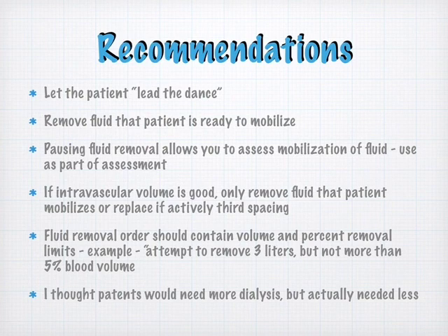And I also feel that since it's really difficult to predict how much fluid to take off, that could be added into what the order for fluid removal is. For example, I would get orders to take off 2 to 4 liters of fluid if possible, and the thing was, I didn't really know whether I could even get 1 liter off of that patient, and nor could the physician, because we just didn't know whether or not the patient was going to be able to give up that fluid. You just don't know. So to me, it's kind of a safeguard, and I think that you can protect patients from crashing if we add percent blood volume change into the order.